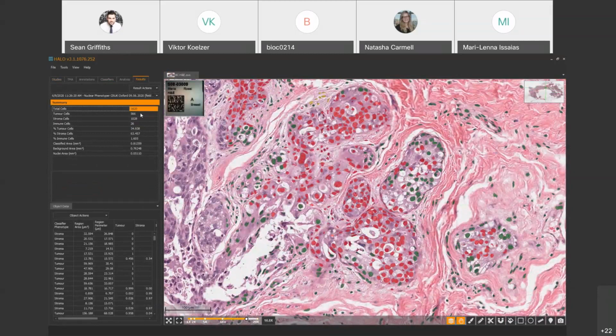So obviously this is as good as the data you put into it. There's the interactive image link that shows you individual cells and what they are. Possibly this needs to be updated. These look like they're incorrectly classified. But this gives you the idea of how you would perform nuclei segmentation and phenotyping using AI.